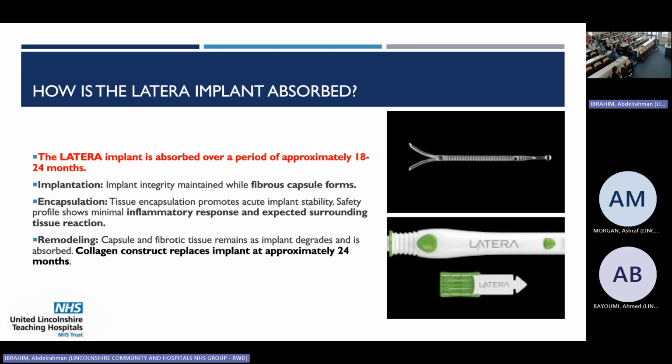And as I said, I don't know exactly whether it's the Latera itself or the other surgeries, but anyway, it works. It saves us from doing a septorhinoplasty for a longer time, and actually Latera takes 5 to 10 minutes each, so 20 minutes. So you don't need to do 3 hours of work with modification of the cartilage. So simply, this is the implant.